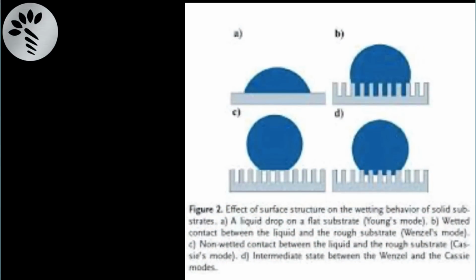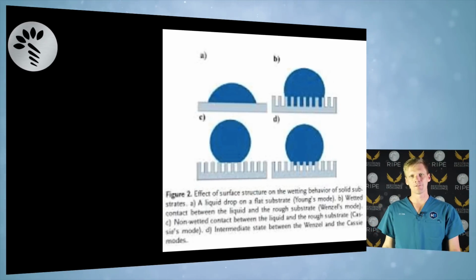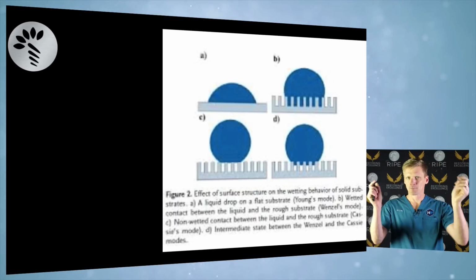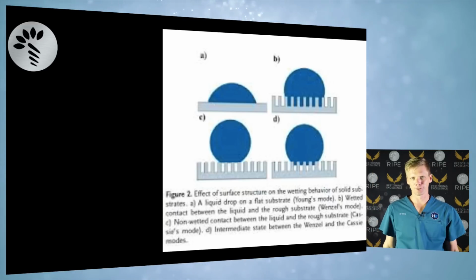That's just for Facebook, and I do that too, but you don't want to be cutting it with a black band burr that leaves giant grooves in it, okay? It doesn't take very long to polish a tooth. I hear people say, if you don't want to polish, it causes trauma to the tooth. That's nonsense, okay? Unless you turn the water off and create smoke signals, you're not going to cause trauma to the tooth.